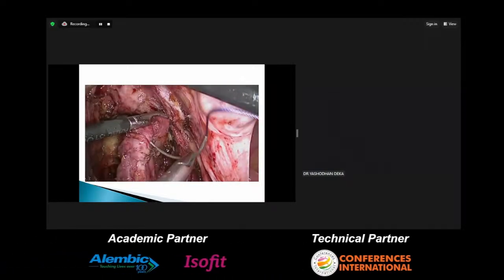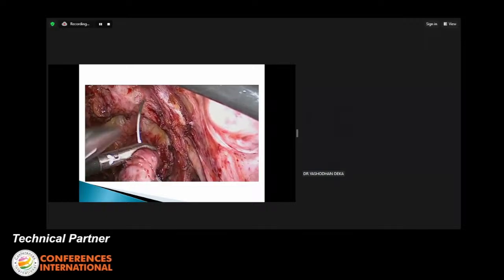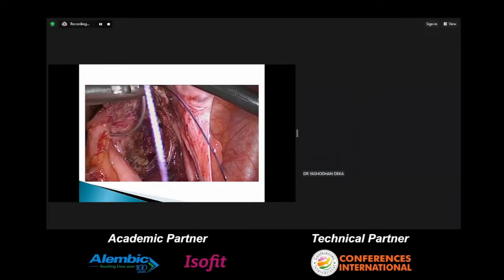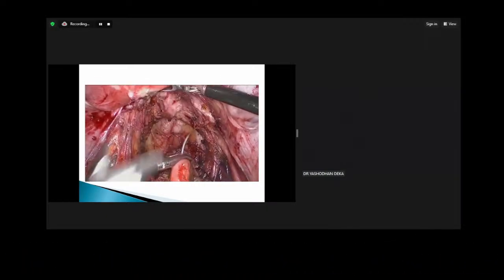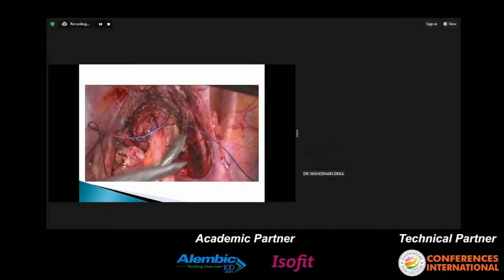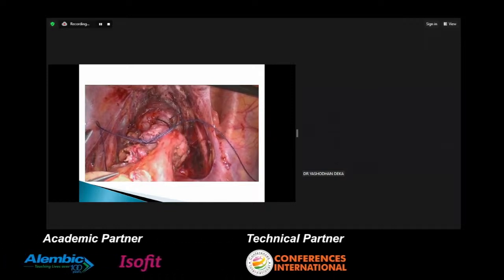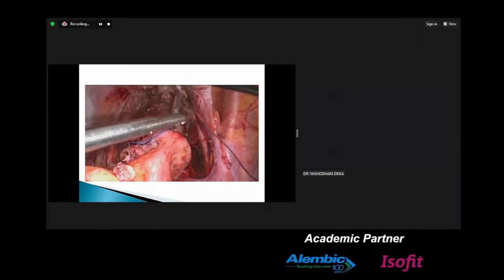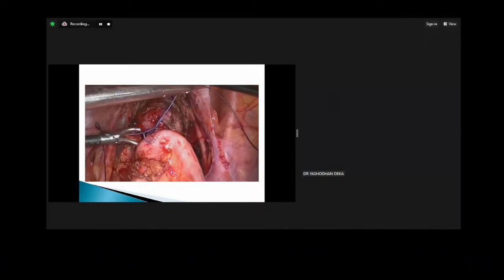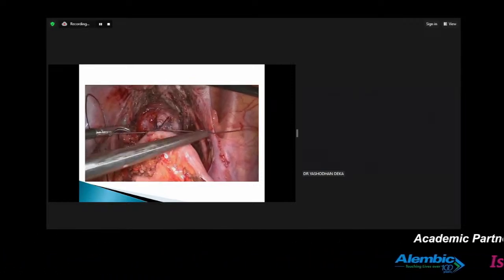So anyways, coming back to the video, we have to take a bite at the distal end and then in the cephalic end of the lesion. Now the lesion is in between these sutures, and then you pass a circular stapler from below and you open the anvil up, and once you tie the knot, the lesion will come in between your anvil and the stapler. When you tighten it, you just push it down.